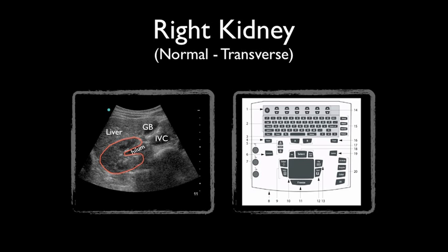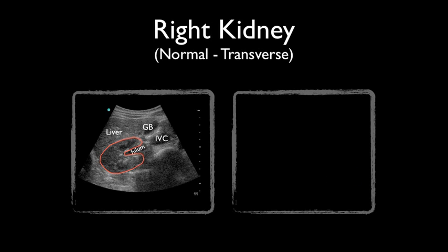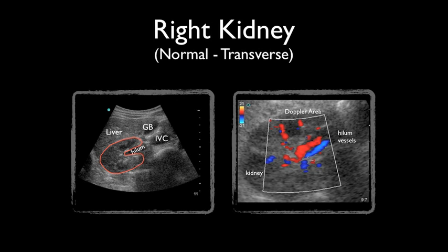From the transverse position, you can see if the kidney has any blood flow. On the ultrasound console, find the color button. Simply place the color Doppler box around the area of the hilum.